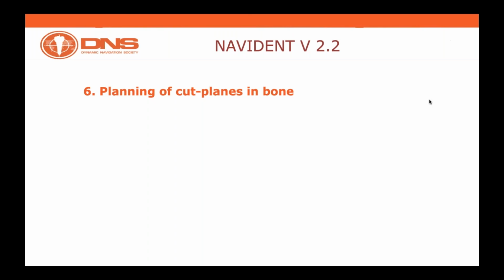So therefore, having an opportunity to improve accuracy, not by matching CBCT data sets, but by matching STL files, would be very helpful, because it could prove accuracy in a completely different domain, which doesn't project any irradiation to the patient. So that would be a very important endeavor whatsoever.